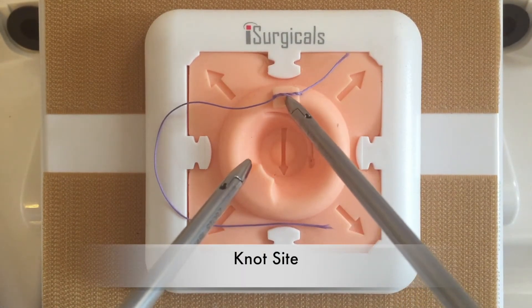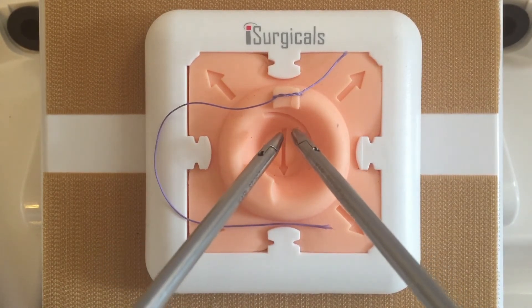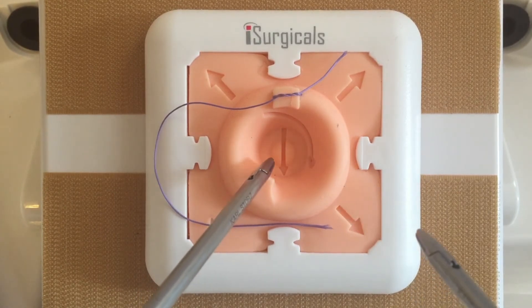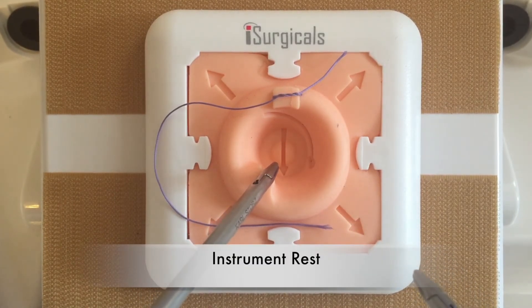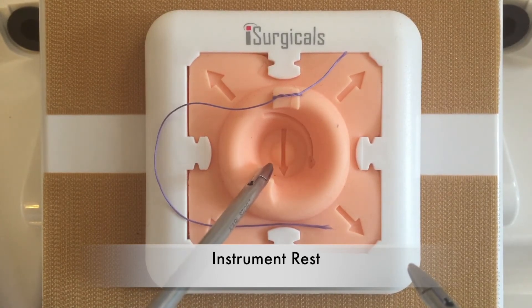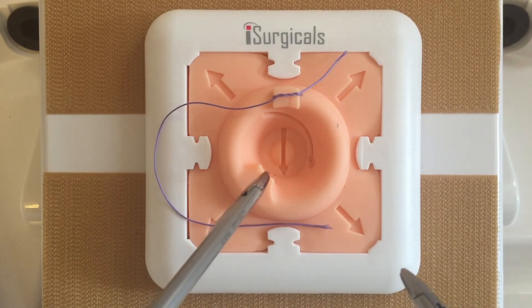The knot site acts as an anchor for the suture above the central crater, thereby ensuring the proximity of the instrument tips during knot tying. The instrument rest has been designed to maintain the left hand instrument in a central position near the knot, reducing a natural tendency for inappropriate movement of the left hand instrument.